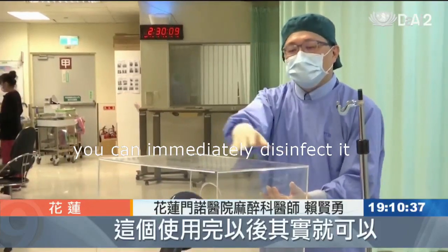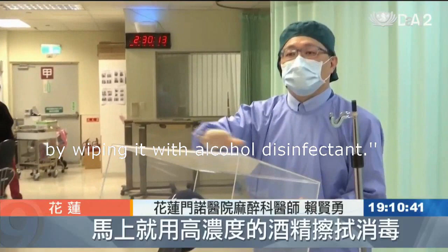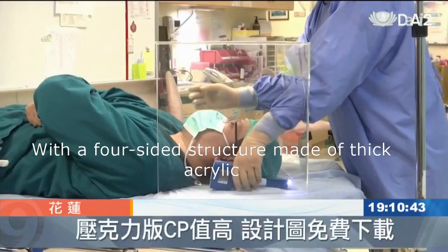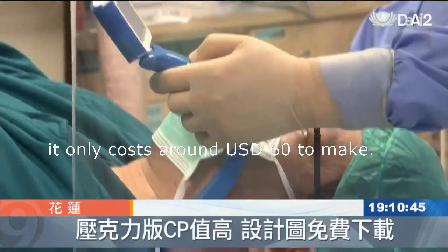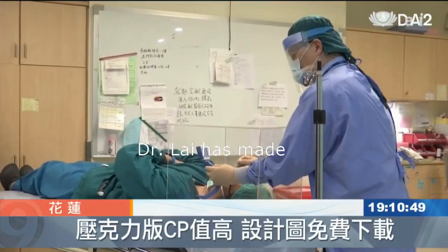After you are done using it, you can immediately disinfect it by wiping it with alcohol disinfectant. With a four-sided structure made of thick acrylic, it only costs around $60 to make. The design is simple but highly effective.